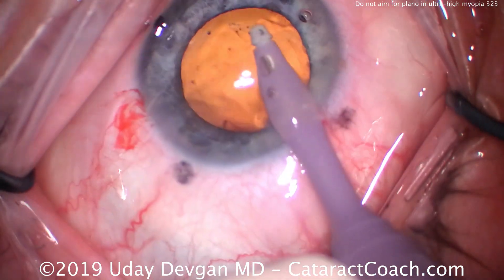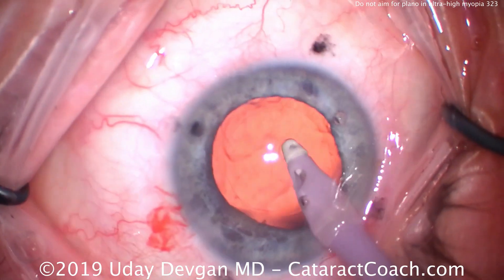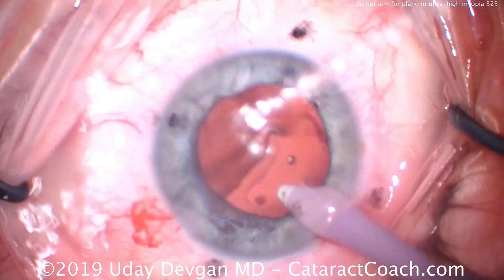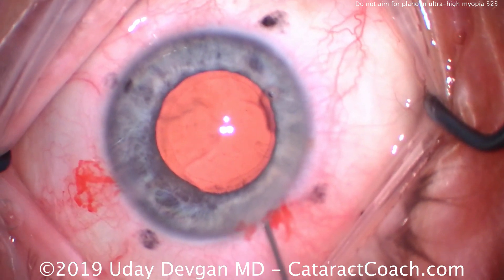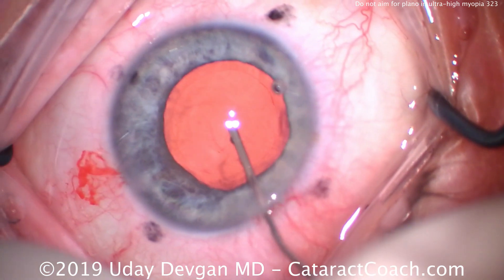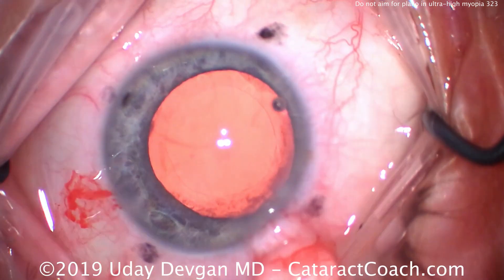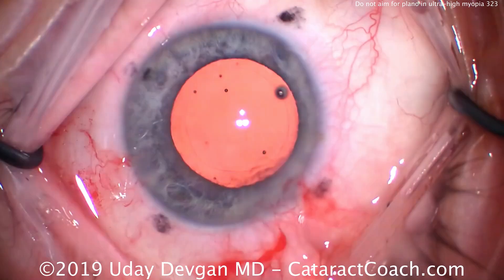With this good eye, the patient mostly uses a cell phone, holding it just a few inches — maybe 12 to 15 centimeters — from the eye, relatively close. So to give that type of focal point, we want to aim significantly myopic. In this case, we're actually aiming for the patient to be in the minus 5 to minus 6 diopter range of myopia.